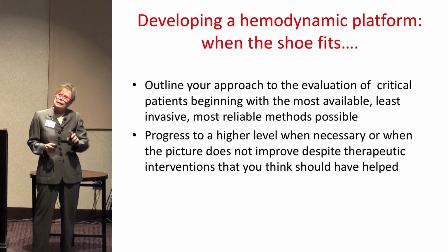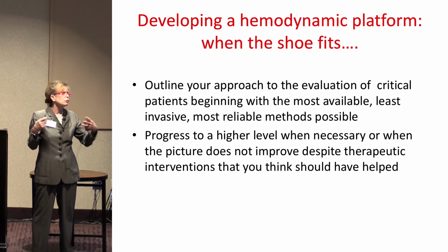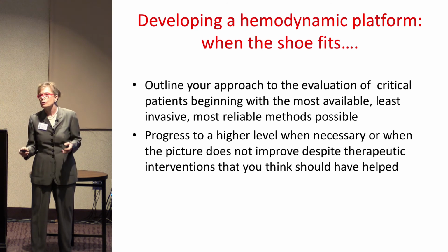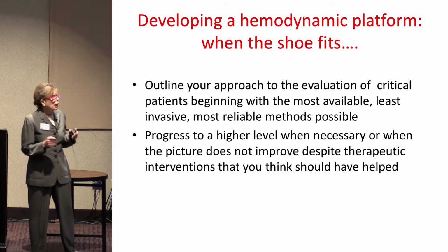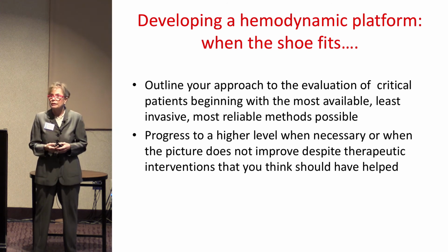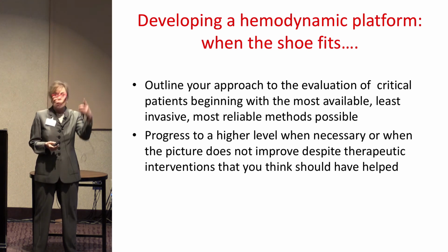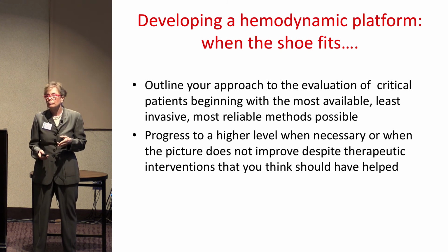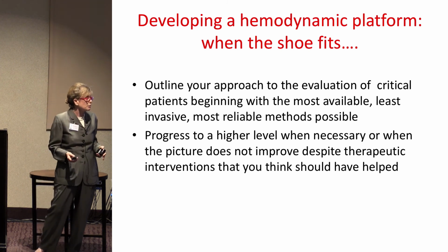One of the things I think is really important for all of us to consider is there really is no one way to evaluate hemodynamics. But I want to be sure that we all appreciate that we're looking at three different things: we look at stroke volume, we look at tissue perfusion, and we look at compensatory mechanisms.